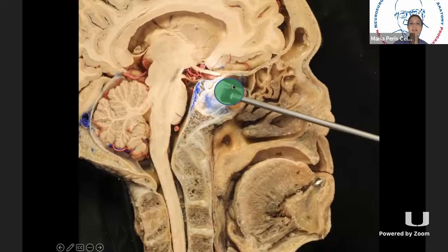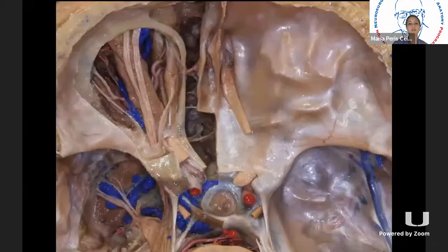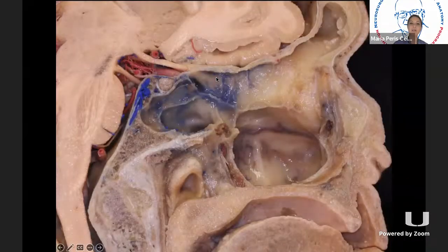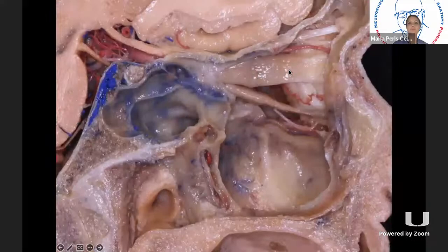And then our endoscopic endonasal approaches really opened a new window into the orbit, orbital apex, and optic nerve and optic canal that are going from medial to lateral. We already talked about the ethmoid labyrinth. We talked about the lamina papyracea and how it joins here and forms the orbital apex and the optic canal posteriorly. The medial rectus and the inferior rectus muscles, and then the main window that we have to operate on intracranial pathologies, which is between these two muscles. Sometimes we can go lateral to the inferior rectus muscle.